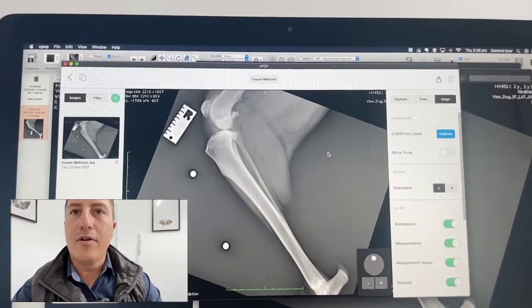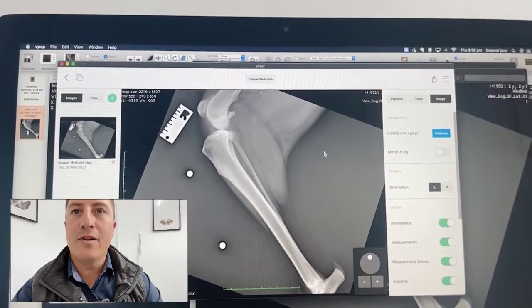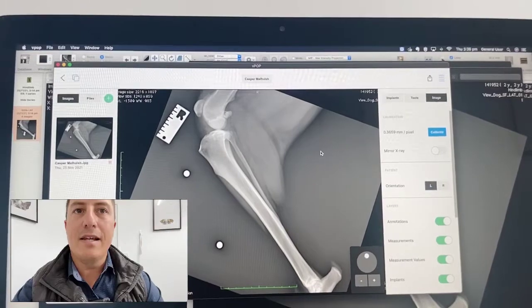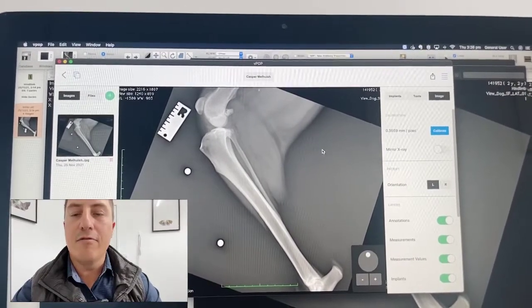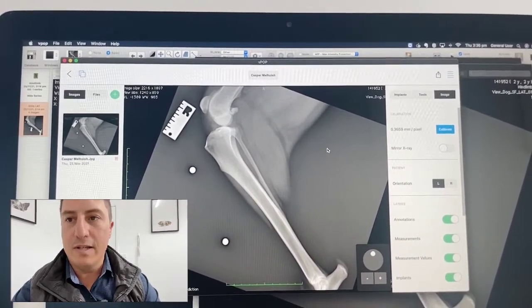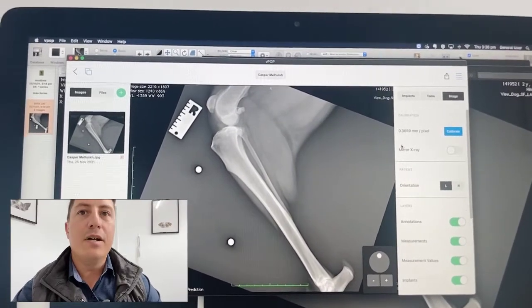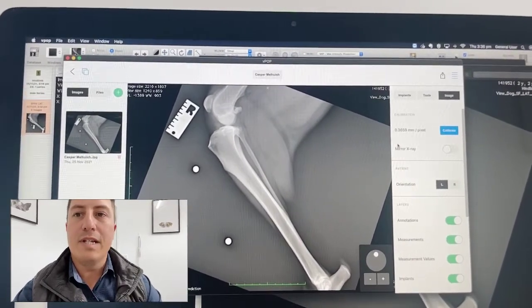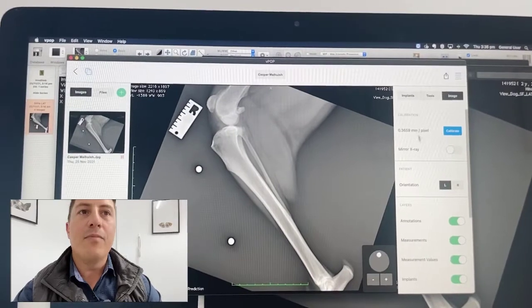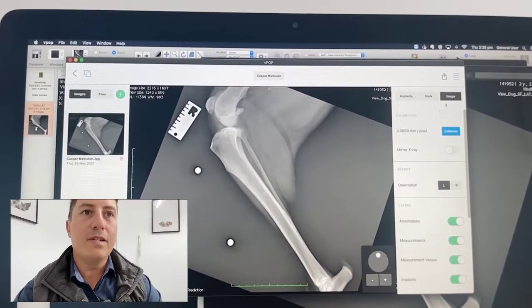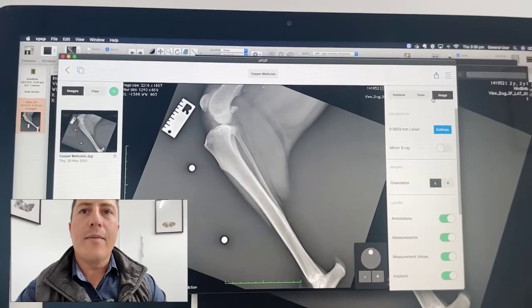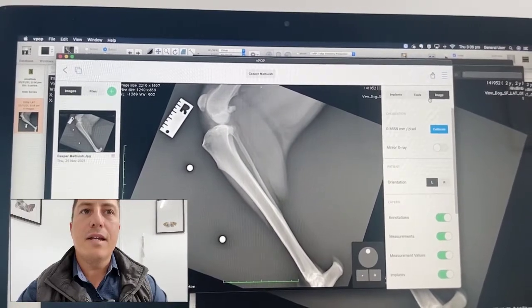What we're using here is a program called VPOP Pro. This is orthopedic planning software developed by a guy called Roy Patton in the UK — a really great surgeon and really nice guy. This software is awesome. I use it now for all of my TPLO planning. I wish this was around when I started doing TPLOs about 15 years ago.